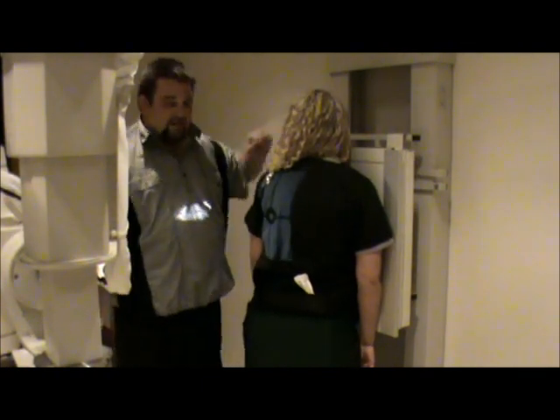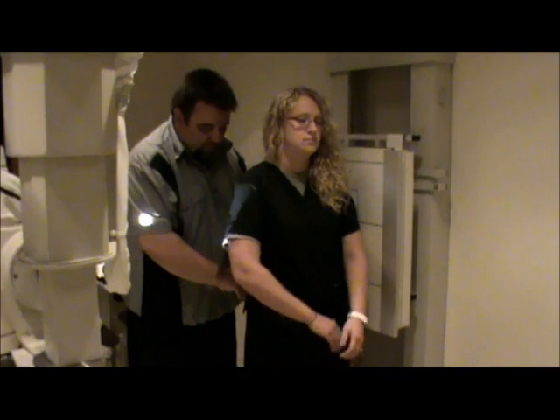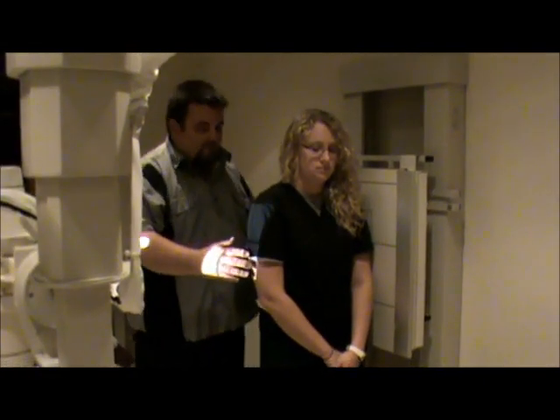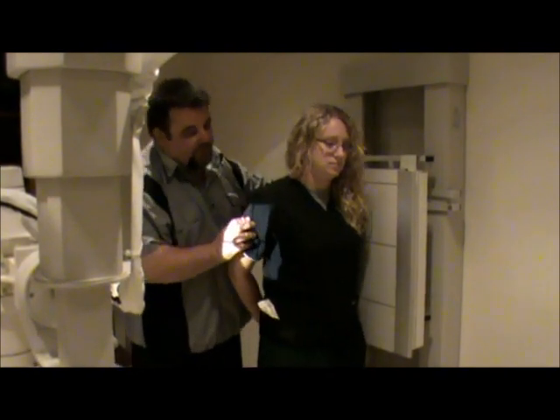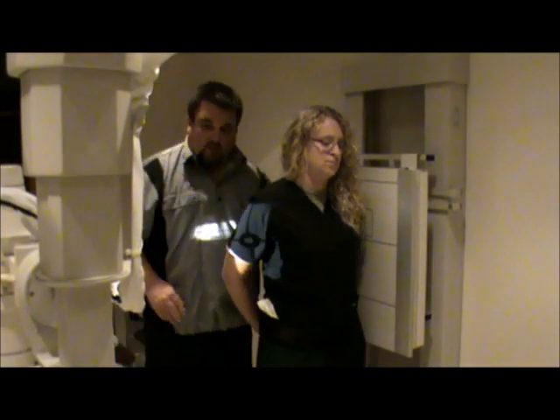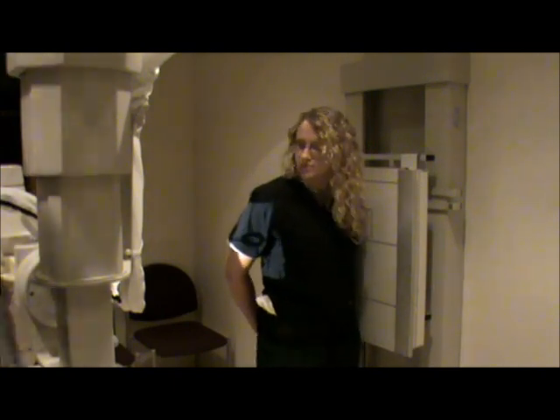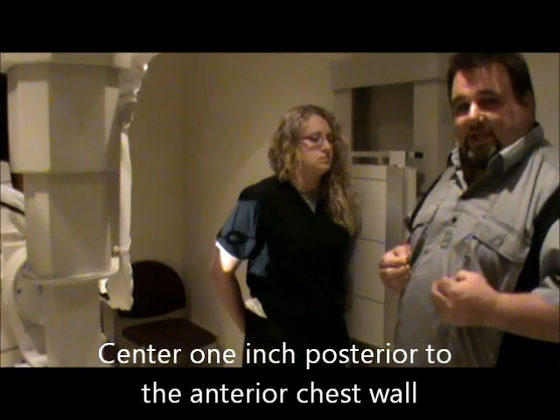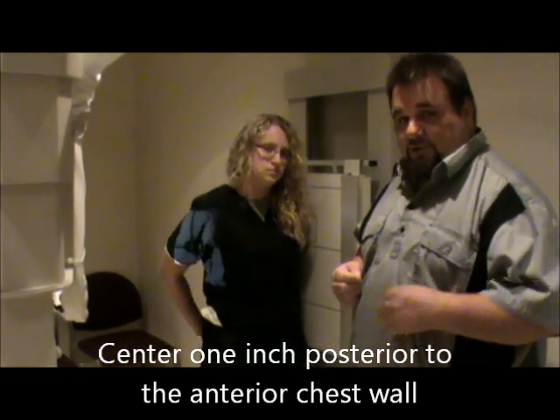Now the other view is going to be our lateral. We're going to have the patient turn and put their side against the bucky. We're going to move the shield to the side. We want the patient to bring their arms back behind their back, pushing their chest out. Centering up and down should be pretty close to where we need it based on where we already positioned.